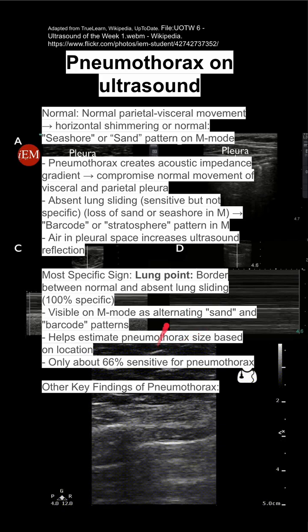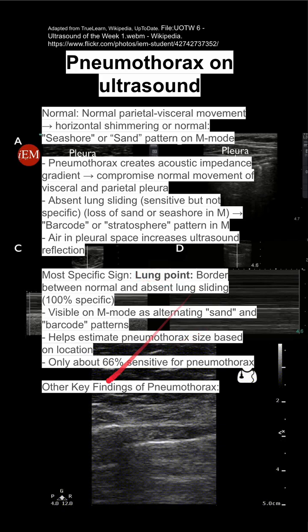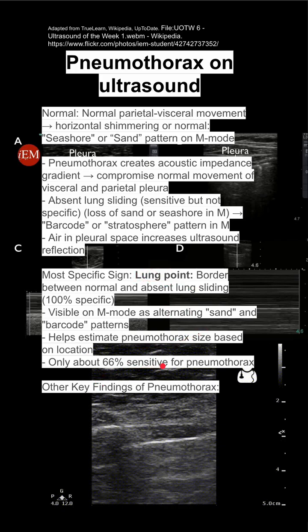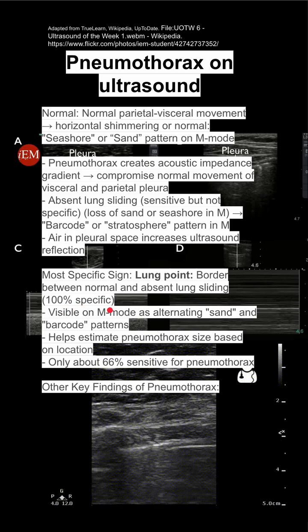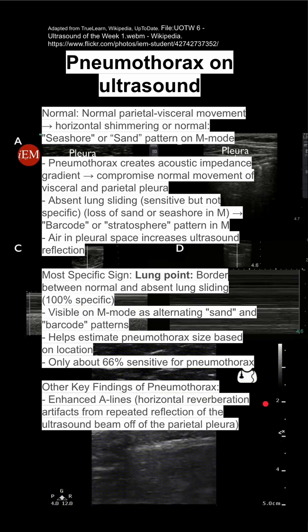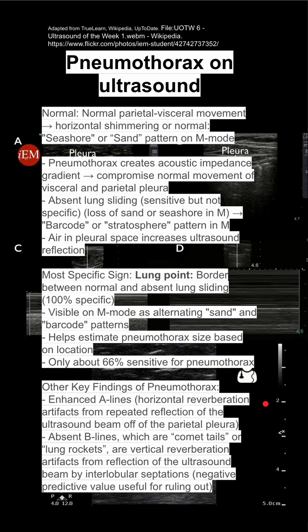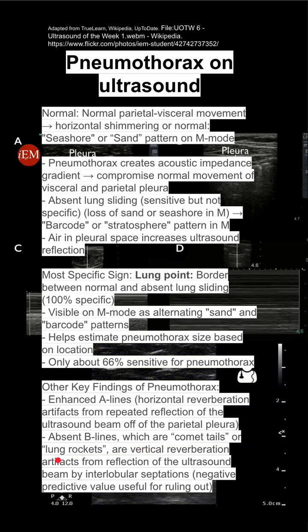However, this lung point is only about 66% sensitive, although it's very specific. Other key findings of pneumothorax include enhanced A lines, which are horizontal reverberation artifacts, and absent B lines, which are comet tails or lung rockets.